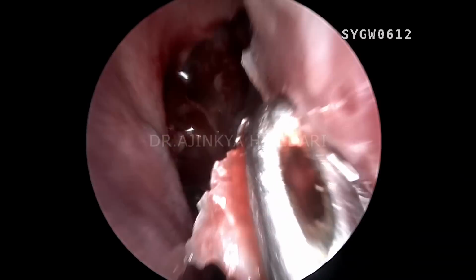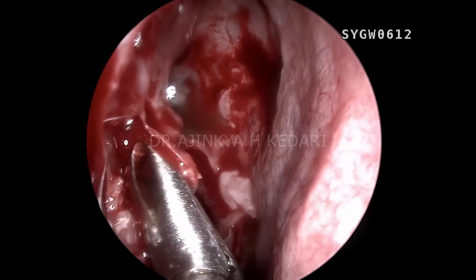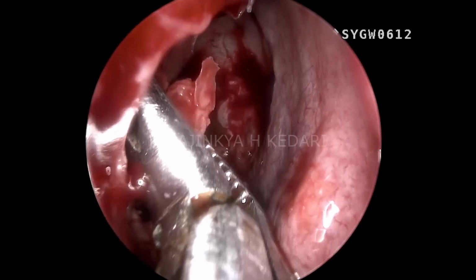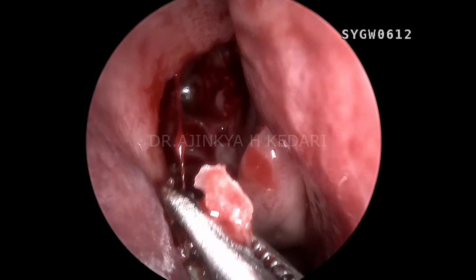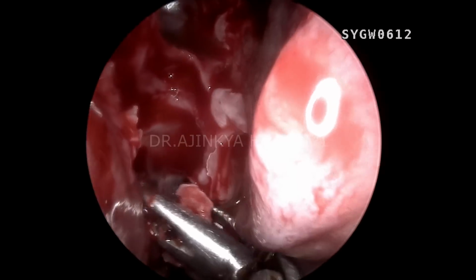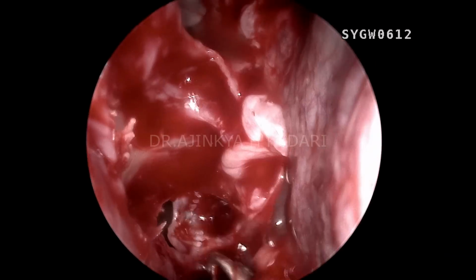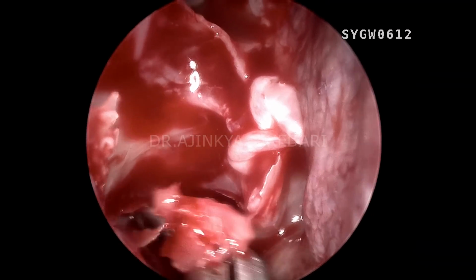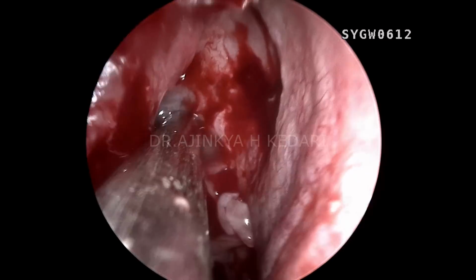So what I'm doing right now is using an upward Blakesley along with the debrider and doing a mini FESS surgery, taking away the anterior ethmoids so far, the vertical part of the uncinate, and later on I'll be flushing the area with the lamina papyracea. I'll be exposing the lamina, the medial wall of the orbit, throughout from the lowermost part to the uppermost skull base level.